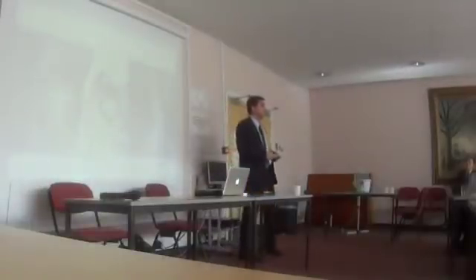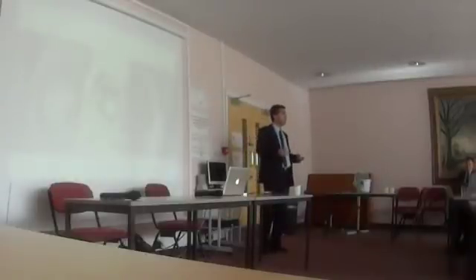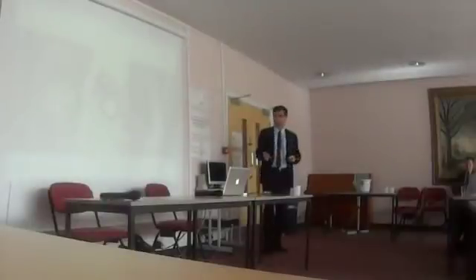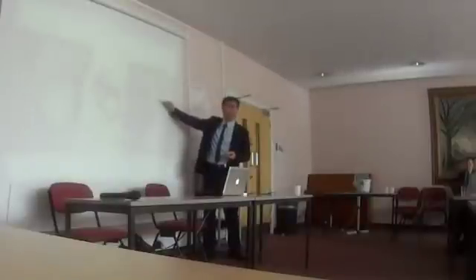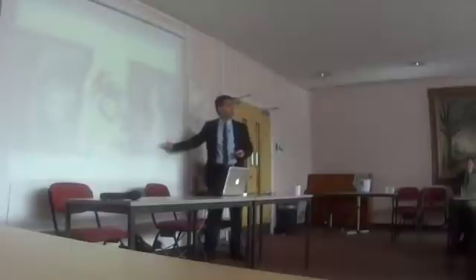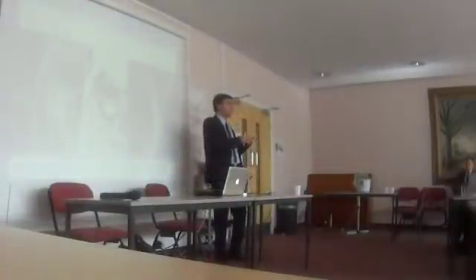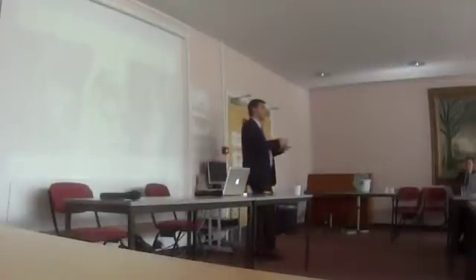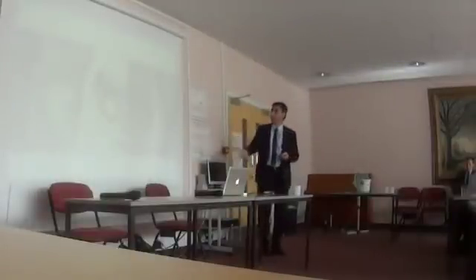Can I have an imaging modality that, when I send the blood, especially for young patients, we can look at everything? There are several reasons, for example, patients can have high blood pressure. One of them is looking at the coarctation, which is a narrowing of the aorta. You can look at the renal artery stenosis. You can look at the adrenal glands. We can look at the heart muscle, where the patient, for example, has developed a side effect of high blood pressure with hypertrophy. We can look at the muscle function altogether. So why not? We can do this test all together.